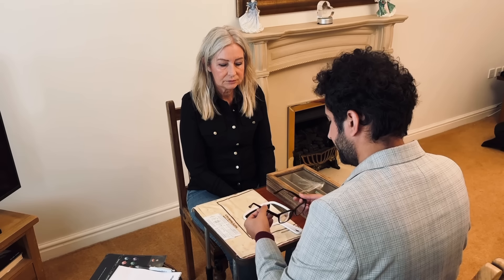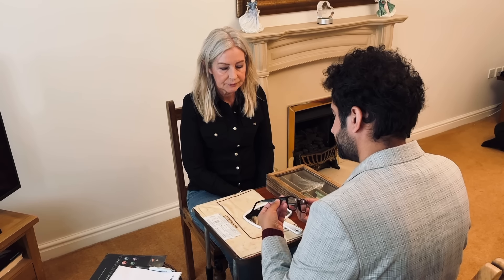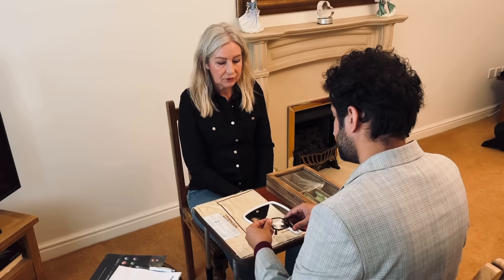Right, so current reading glasses, let's have a look. They do need tightening up there, but are you looking for something similar? Yeah, I think so. In terms of plastic style? Yeah, lightweight. All right, and what about colours? Are you open to different colours? Yeah, I'd like to try a different colour this time.